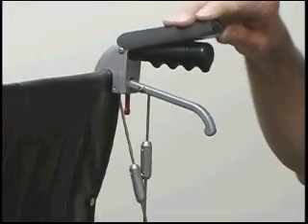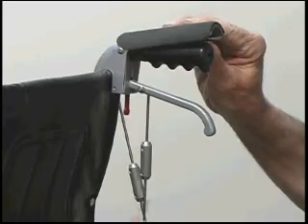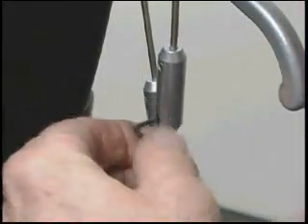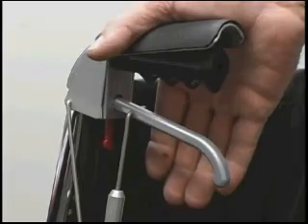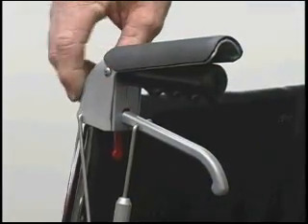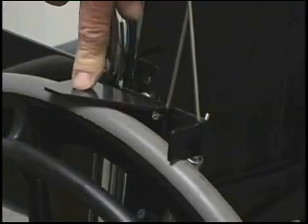To adjust lever height on the attendant brake, a hex wrench is used to loosen the bottom set screw. Adjust to desired height and tighten the set screw. Our incline brake system features an actuating lever that mounts into the existing bracket for the attendant brake or Jerry-Lock brake systems. The actuating rod adjustment, and the brake shoe or brake paddle.